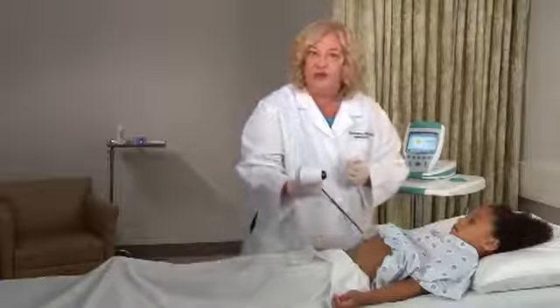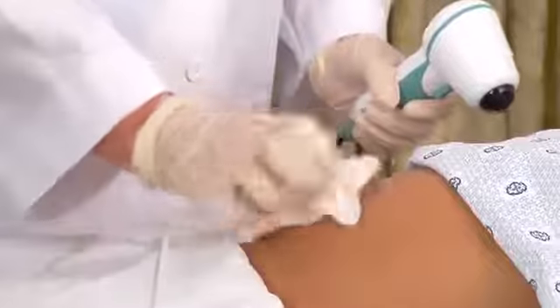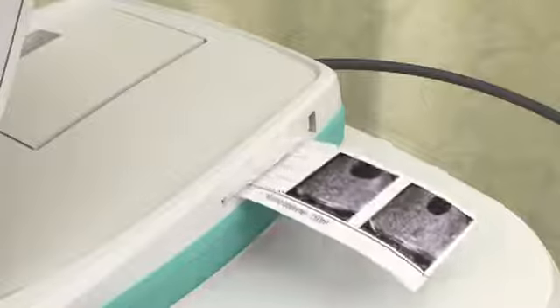When you have verified an accurate scan, the screen will display your results. Wipe the gel from the probe and from the patient. At this point, you may record a voice annotation to save your exam, print the exam result from the onboard printer, listen to previously recorded annotations, or review data from saved exams. You can also return to the home screen and perform another scan, or you can turn off the instrument.